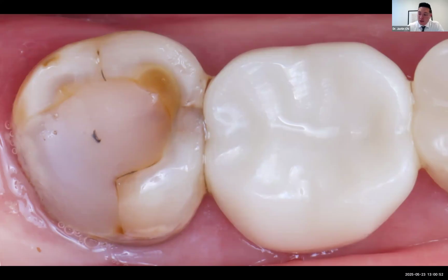Technically, most of the studies that I've seen are in favor of polymerizing the bonding agent. I think there's a little bit higher bond strength, but as far as leakage, I suppose it's possible if you have excess bonding agent, maybe the strength of the bonding agent is not so strong in a certain area and you have it pooling in a certain zone. But that's something I'll have to look a little bit more into. Not to my knowledge, but just thinking maybe in excess, there's a possibility.